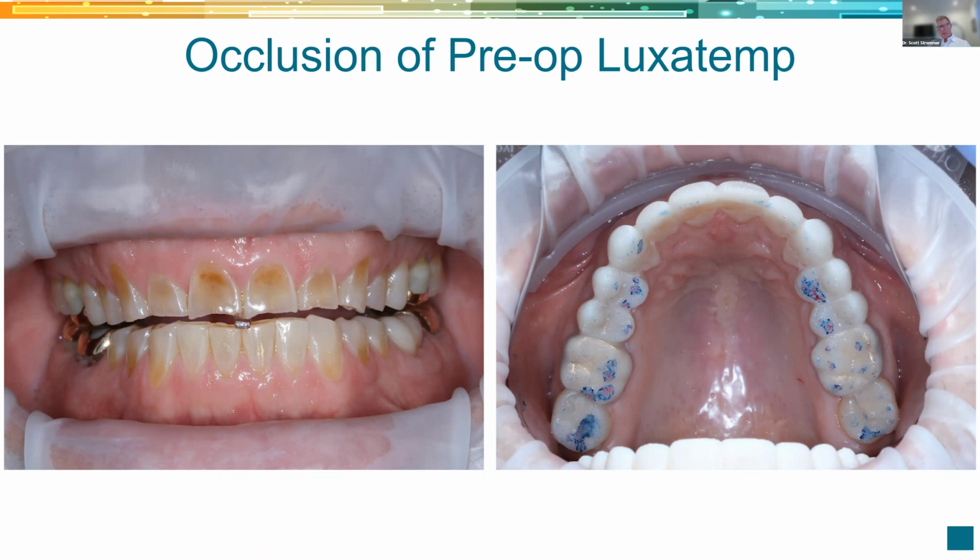So remember, Eric was deprogrammed, as we say, and we go ahead and put this in place, and I can spot in his bite right here. This is really, for those of you that do these cases, you're already having a good feeling here. You're looking at this and you're saying, all right, this is going the way we want it.